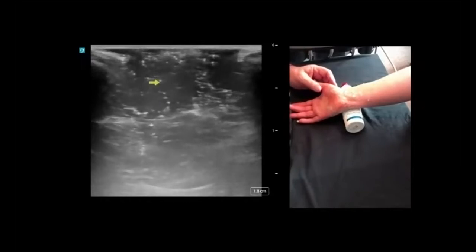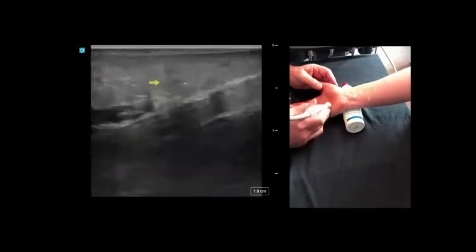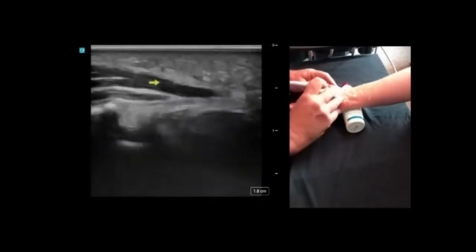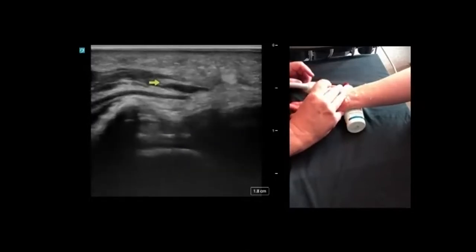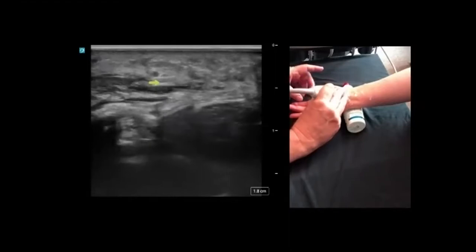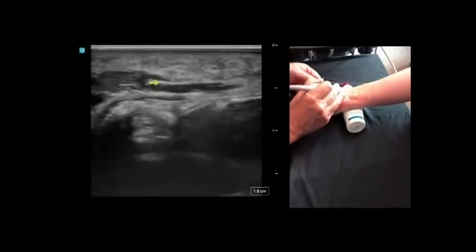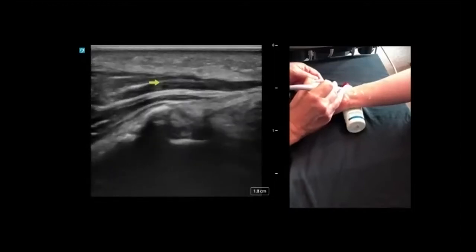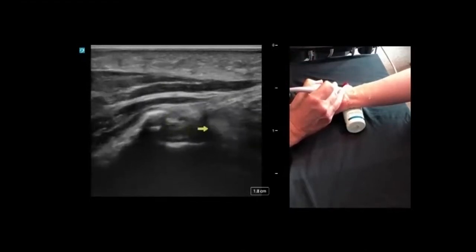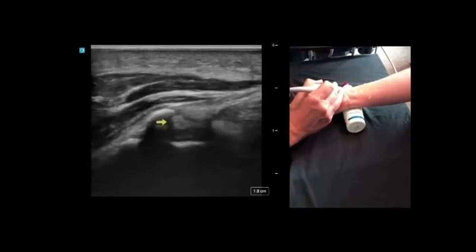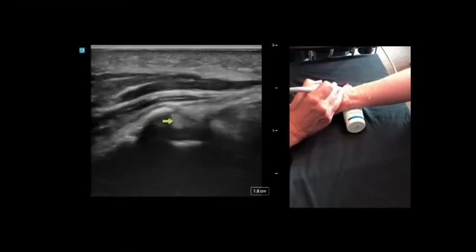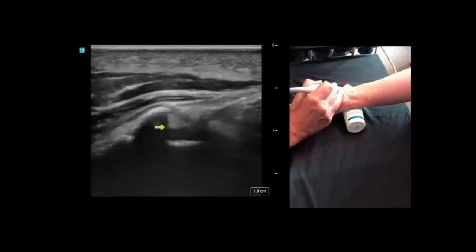Daniel asks Bill to return to the distal carpal tunnel to clarify a landmark. Let's wiggle the thumb to clarify where the FPL is versus the FCR. There's the FCR — the little oval — and the FPL which is somewhat anisotropic. One moves and the other doesn't, which is a super cool dynamic way to differentiate — just make it move with ultrasound. Confirmed: that was the FCR and this is the FPL.